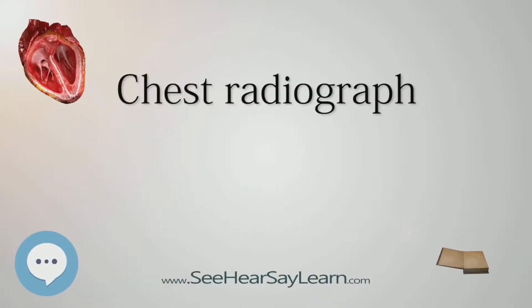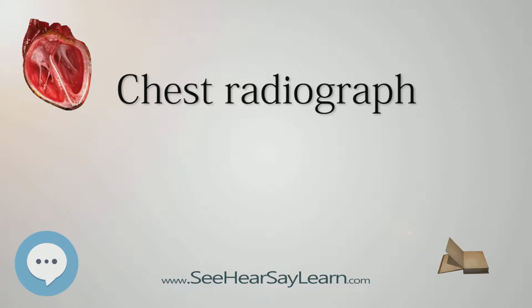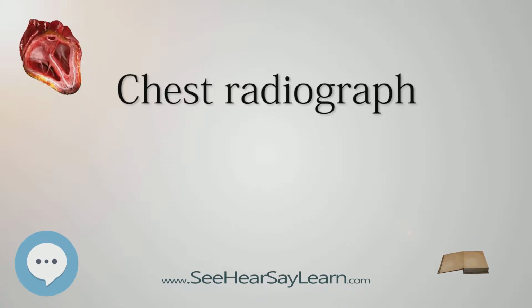A chest radiograph, colloquially called a chest X-ray, CXR, or chest film, is a projection radiograph of the chest used to diagnose conditions affecting the chest, its contents, and nearby structures. Chest radiographs are the most common film taken in medicine.